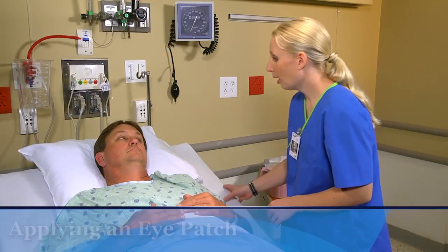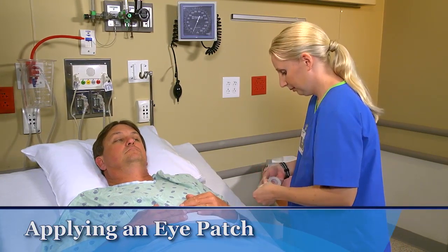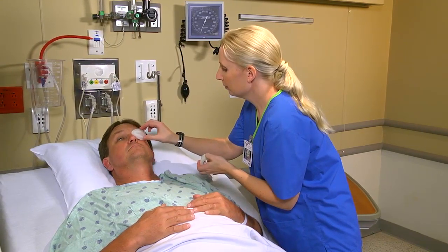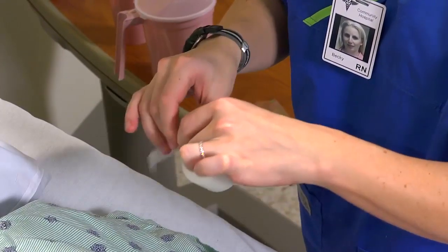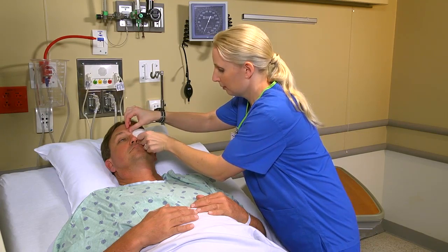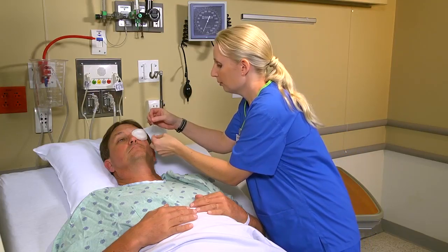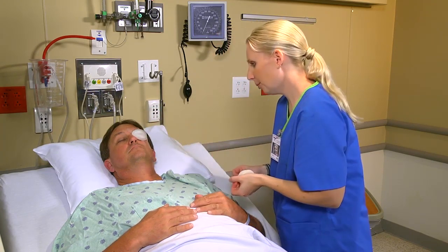I'm now going to place your eye patch on. If an eye patch is needed, place a clean one over the patient's affected eye, covering it completely. The patch must be taped securely, but it shouldn't press on the eye. I'm going to secure it with 2 pieces of tape. One more piece. Does that feel comfortable? That's fine.